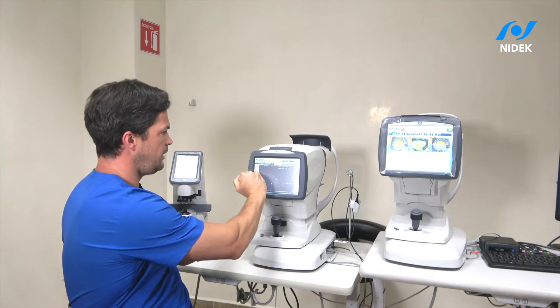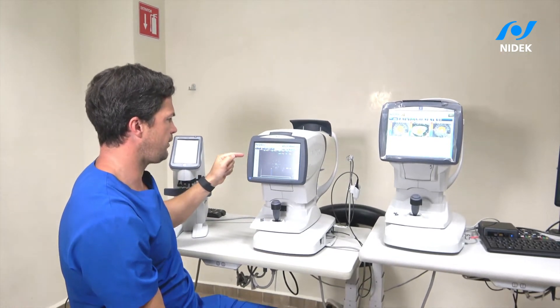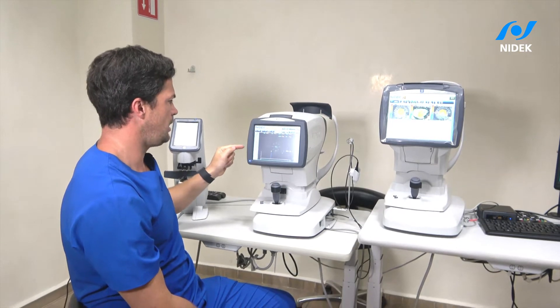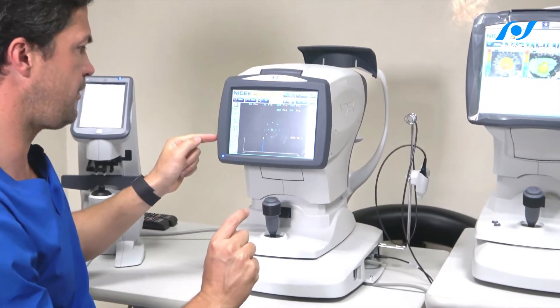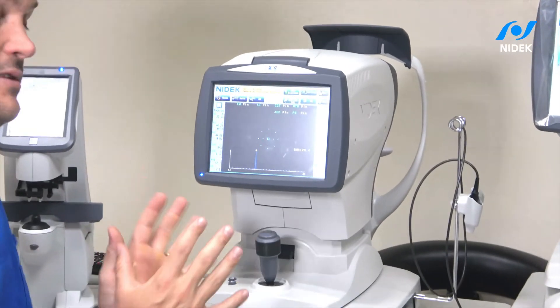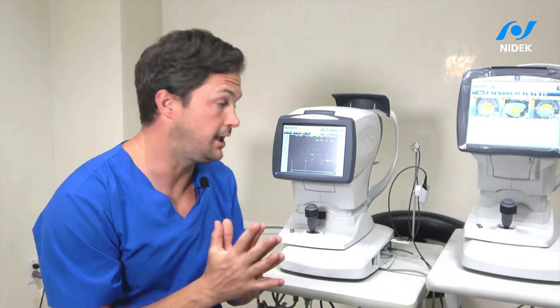What we did is we measured the actual axial length, keratometry, CCT, and anterior chamber depth, along with white-to-white. With this information I can probably use 100% of the formulas because I have everything that I need.